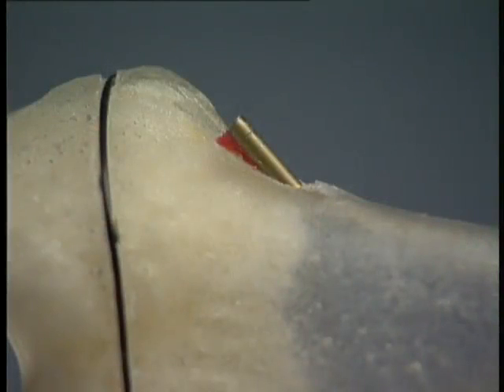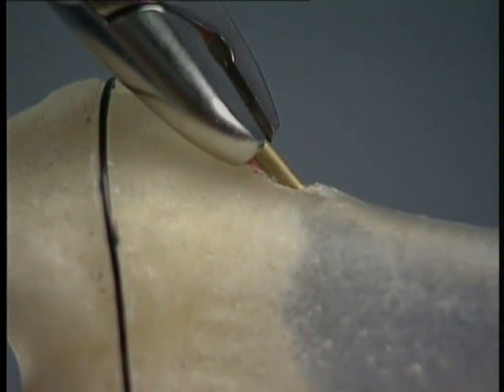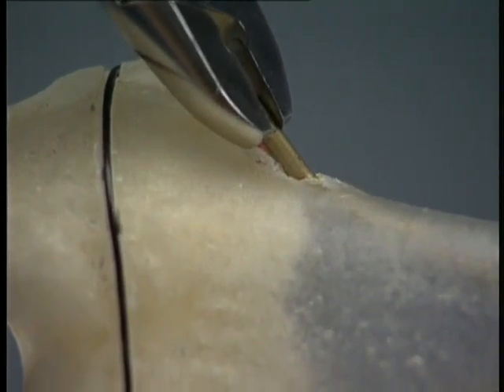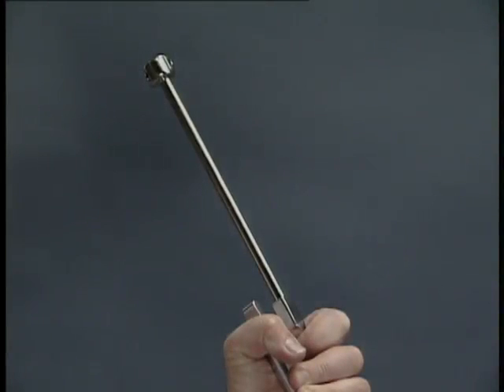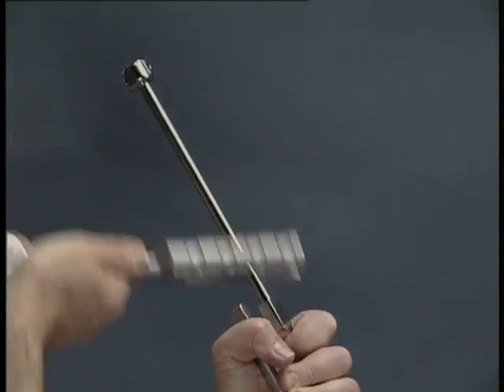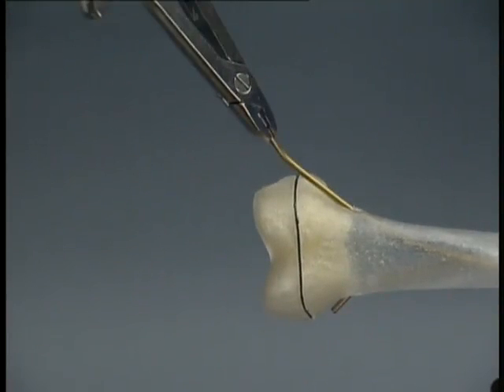For nail removal, after the old incision has been opened, the end of the nail is exposed and held with the extraction pliers. The end of the nail should first be bent so that it is lifted clear of the formed callus. With the hammer guide firmly screwed onto the extraction pliers, the nail can be easily removed with strong axial blows along the guide. The bend at the end of the nail can be clearly seen.